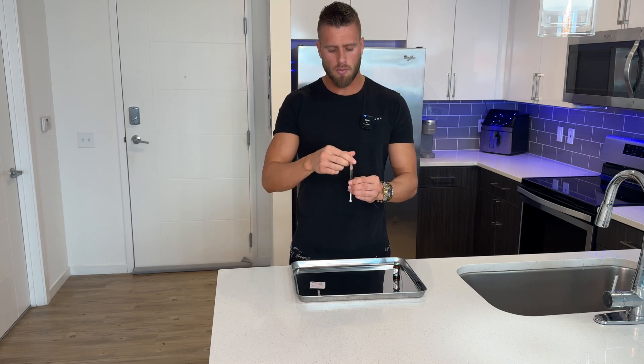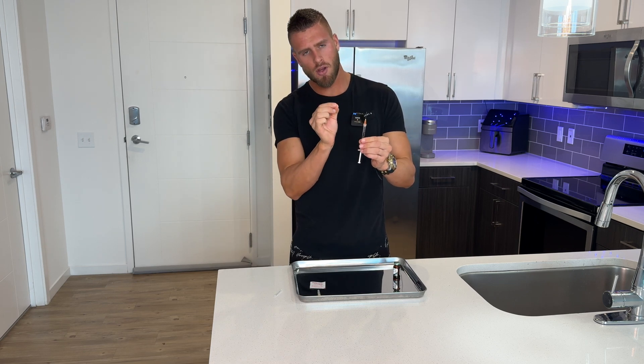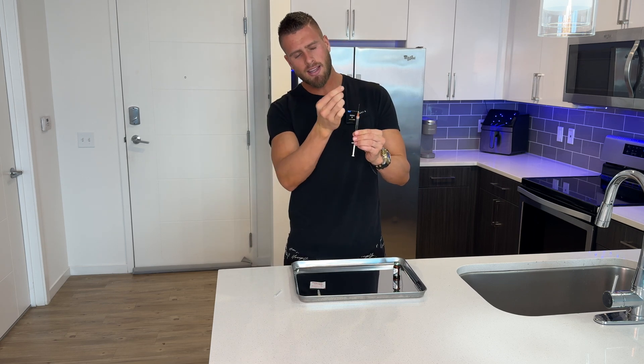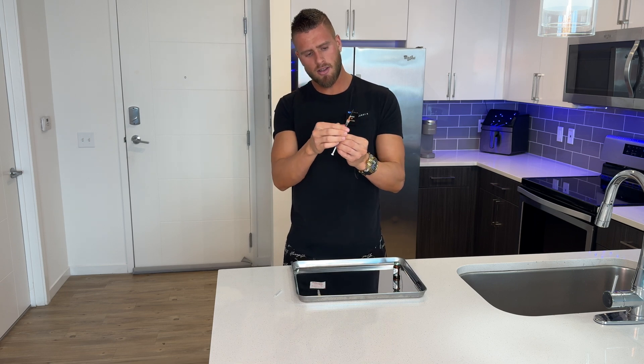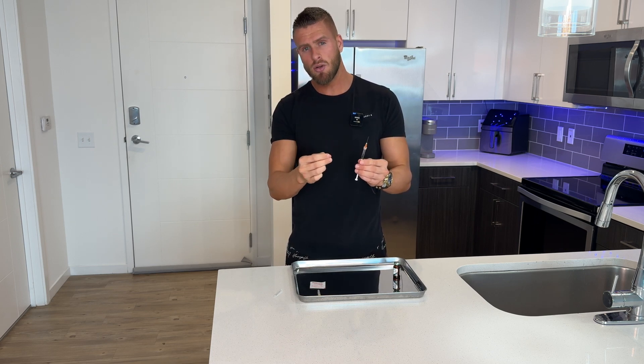Now that our injection is ready to go, I wanted to share one tip that helps make your injection process pain-free. Remove the cap from the needle and squirt a little bit of the oil out of the tip and let it run down the shaft of the needle. Spin the needle a little bit while the drop is going down the shaft. The reason to do this is to make sure the shaft is lubricated, because a completely dry needle is gonna hurt a lot more than a lubricated one.